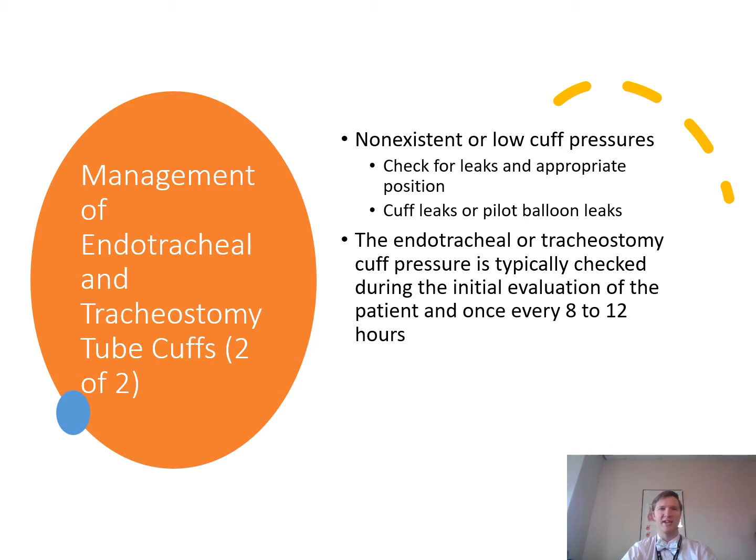There was a 2-year study of massive airway leaks that produced an important finding: a large number of ET tubes that were removed after apparent defects or damages were actually flawless. So tube malposition was almost the most likely explanation of these results. In other words, it was the tube position, not the valves or the leaks, that was most likely the cause for these issues. So investigating the leaking airway should precede any decision to change the tube.